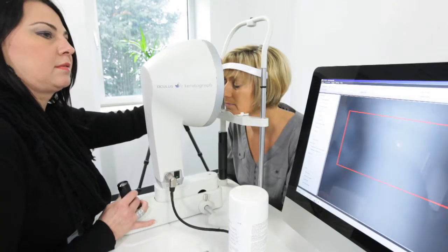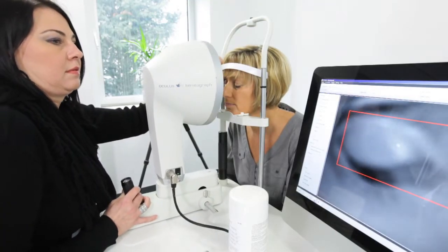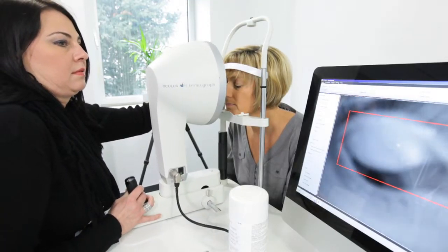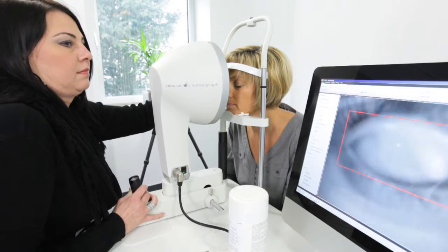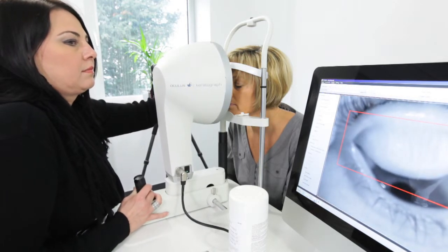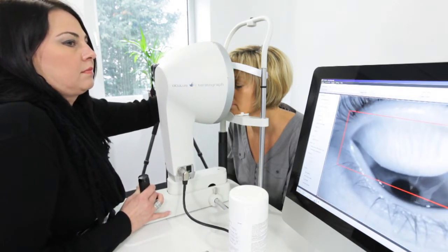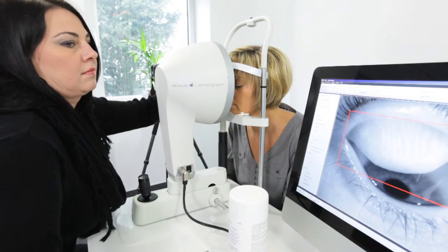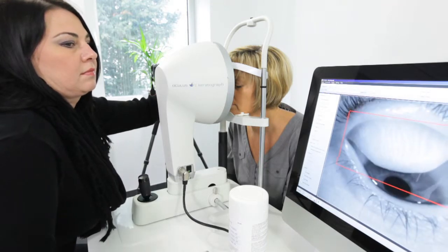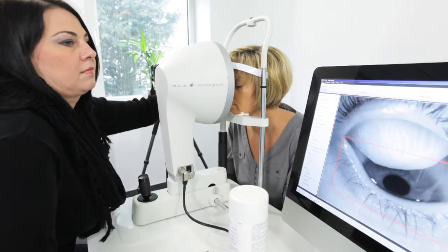After the upper eyelid is inverted, move the Keratograph back and forth until the meibomian glands are seen clearly. When you see the meibomian glands sharply, click the button — single image or video.